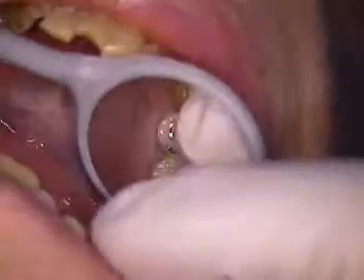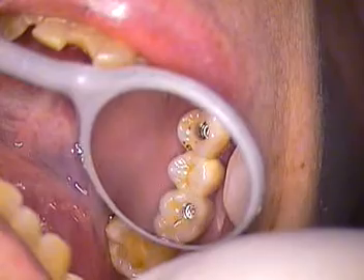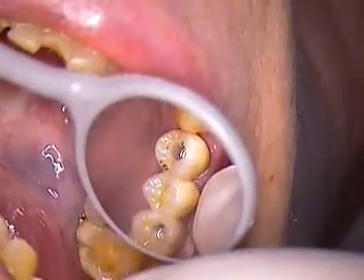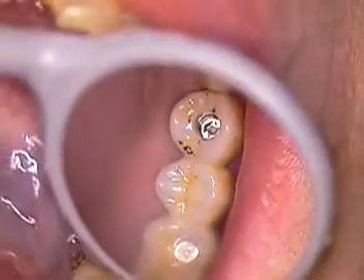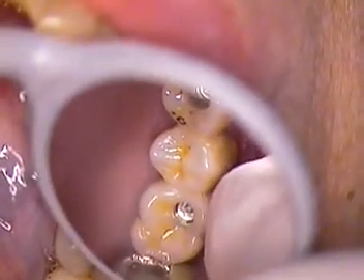This will be a shout-out to Bob. This is the full contour now — we're going full contour zirconia. We did have them glaze and stain that, but it's all one piece. There's no layering involved. We've got the very strength coming from all the ceramic material.